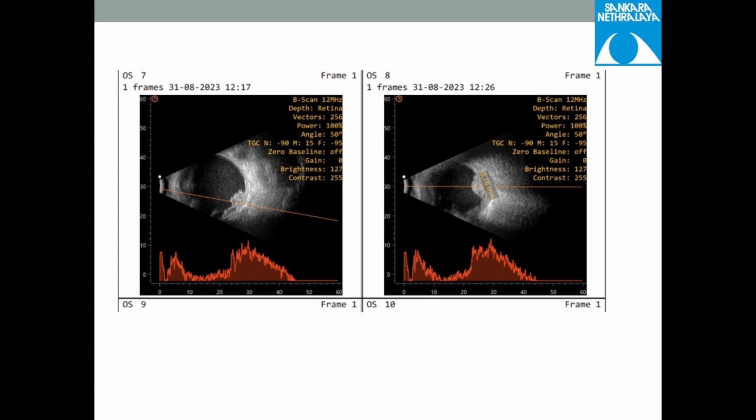And what will the longitudinal scan give you? Anterior posterior. Yes, that can also be given. We need three measurements. The height, which is the maximum height in either the transverse or the longitudinal scan, and you give the transverse dimension and the anteroposterior dimension from the longitudinal scan.